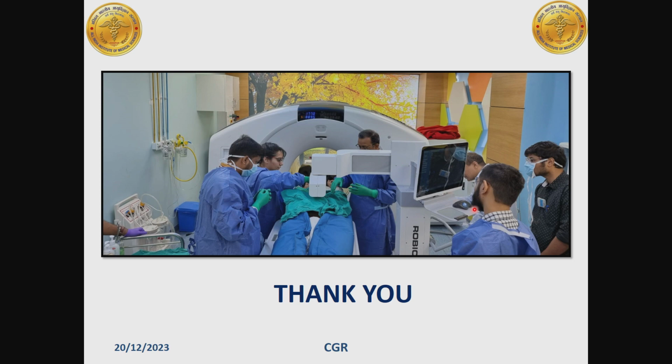An example is a breast mass that is easily accessible to ultrasound. So why expose the patient to radiation? But if that breast mass has heterogeneous enhancement and a heterogeneous uptake on FDG, then it is better to do a PET CT guided biopsy in that case, irrespective of the anatomical imaging.